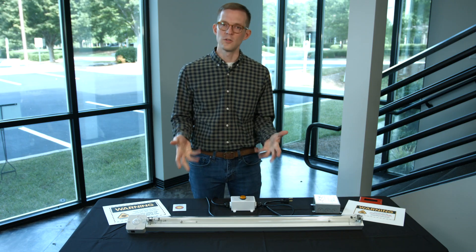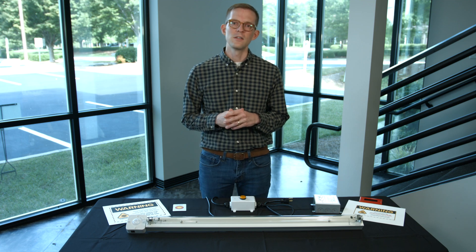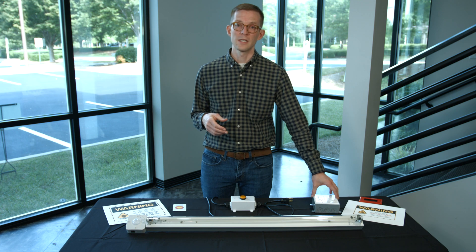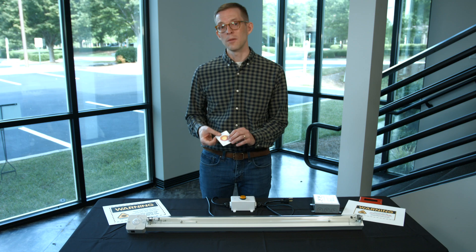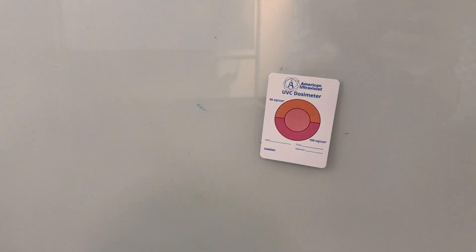One way to determine the run cycle for a fixture is to install it in a room with the ability to select different run cycle times through a control system or countdown timer, and then at commissioning, place multiple dosimeter cards around the room.